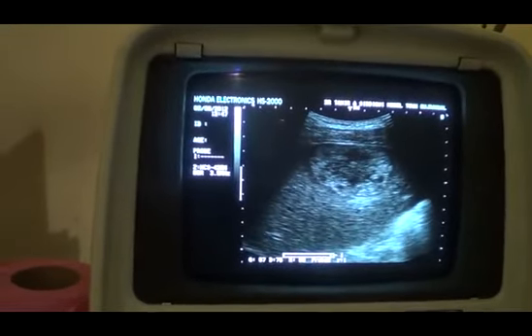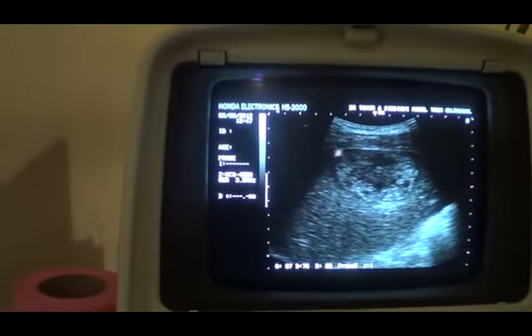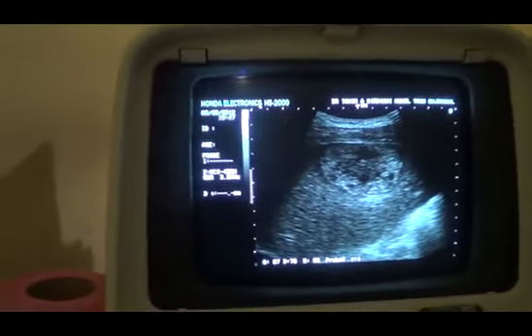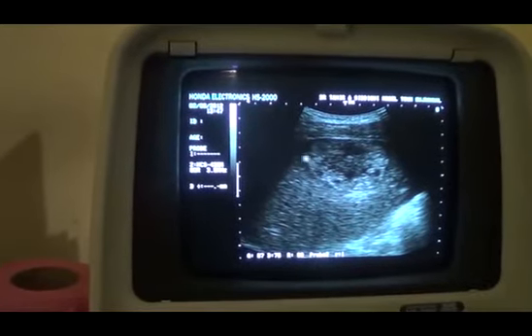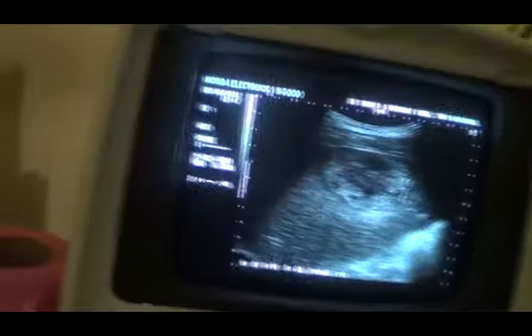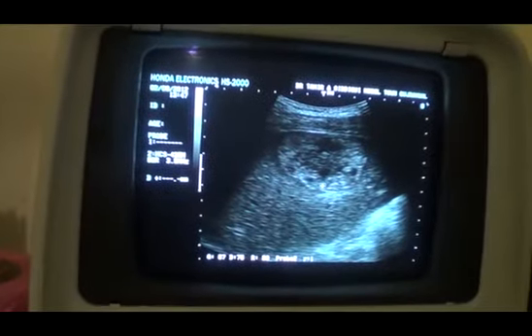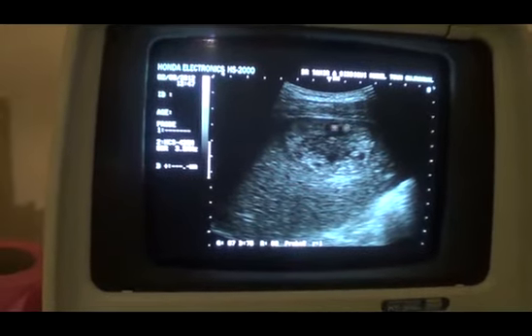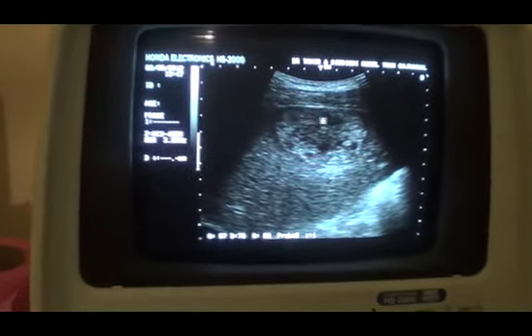Now you see, this is the focal lesion. This is the echogenic boundary, and this is the black area, the hypoechoic area around this solid echogenic mass. Now this is the halo around it, and these are the cystic areas.